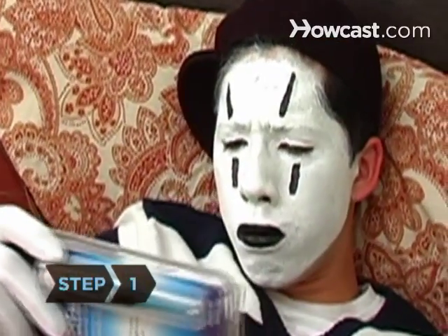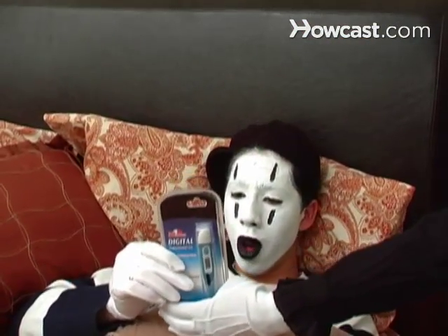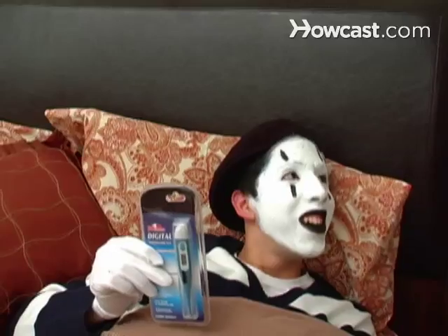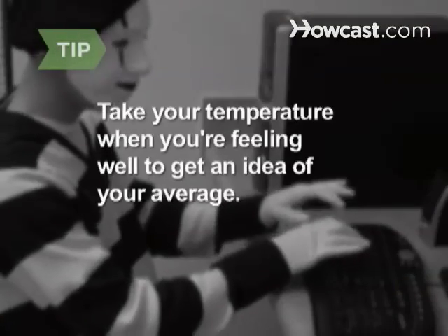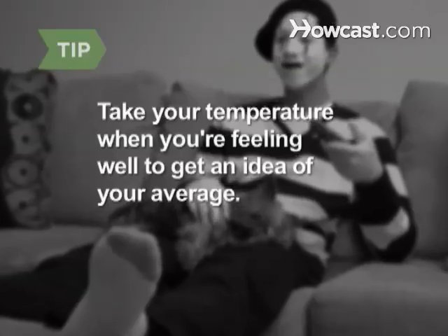Step 1. Choose an oral, arm, ear, pacifier, or rectal thermometer. Purchase a digital thermometer, as they provide the most precise reading. Take your temperature several times when you're feeling well to get an idea of your average body temperature.